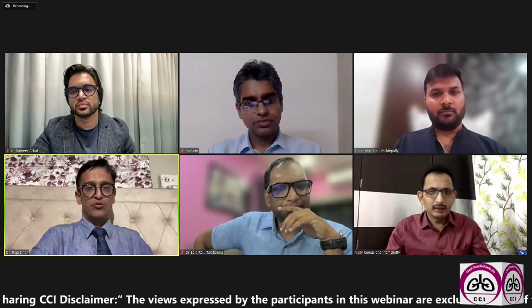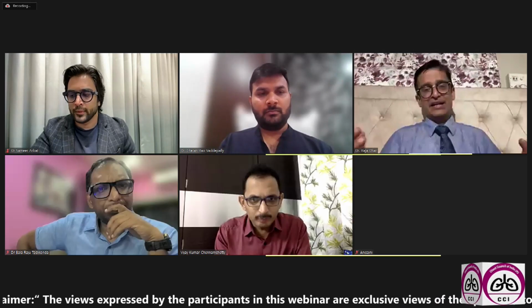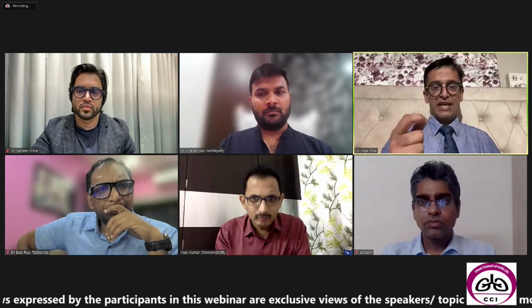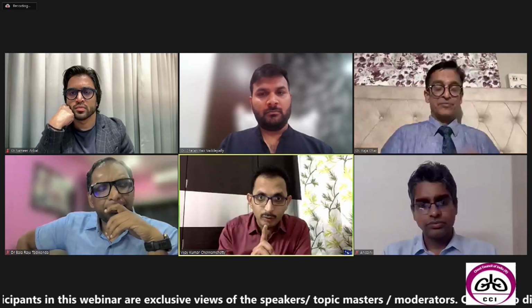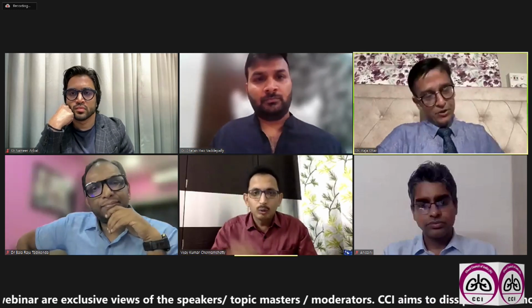There's also the question of causing a bronchopleural fistula. So I think a word of caution needs to be exercised about taking these drains out in 3 to 4 hours. We discharge the patient with an ICD once the patient is stable on room air and maintaining saturations.